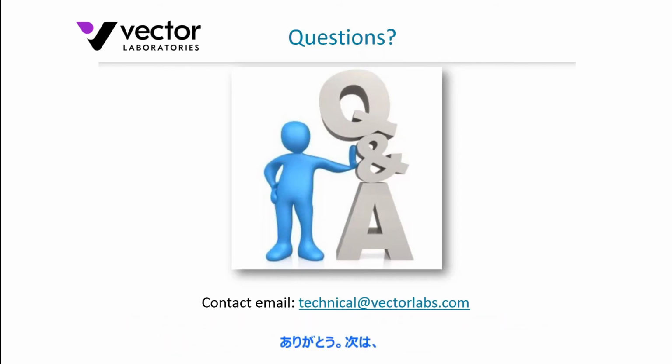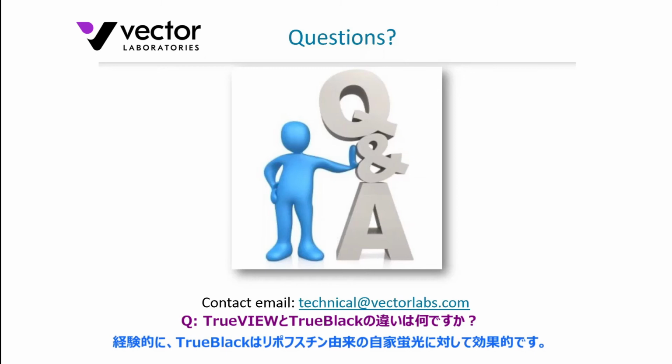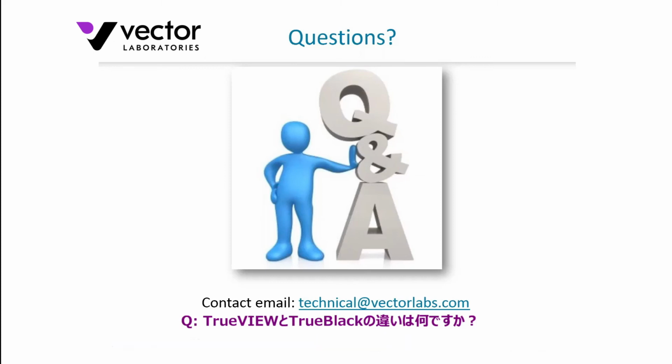Okay, great. What is the difference between TrueView and TrueBlack? Can TrueBlack be used to quench all kinds of autofluorescence? Yeah, fair enough. So TrueBlack is a trade name of a product. It's an ink-based reagent from the company Biotium. And at least from our experience, we've seen TrueBlack to be effective against lipofuscin.